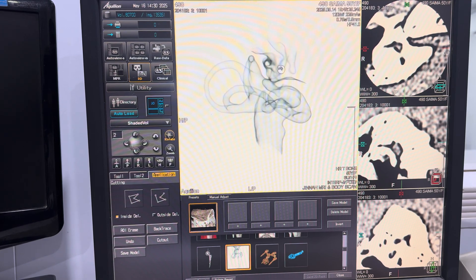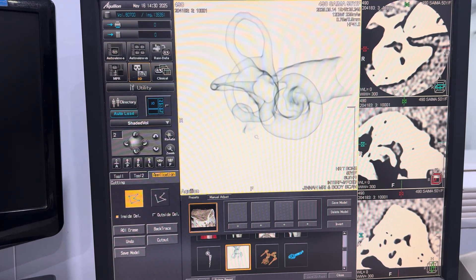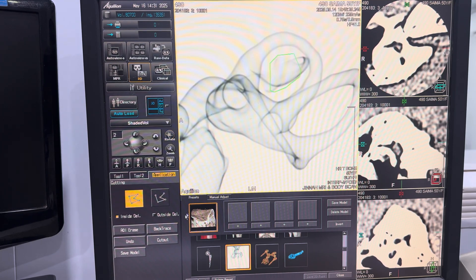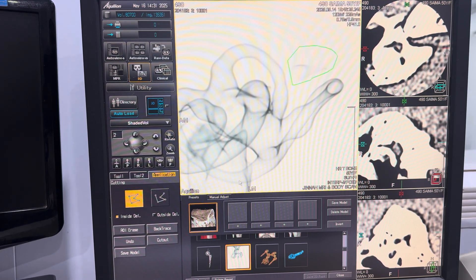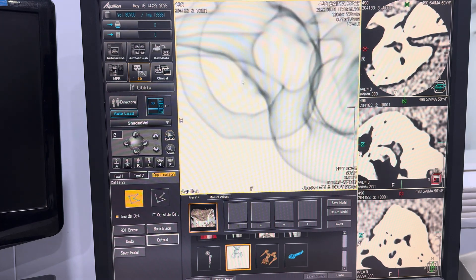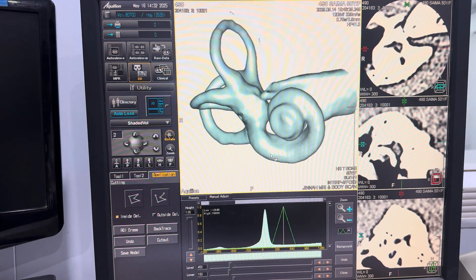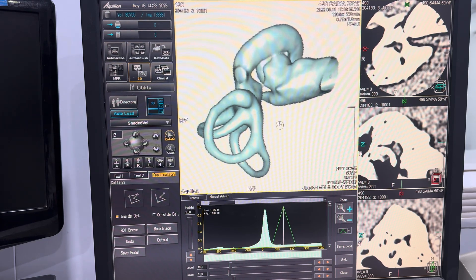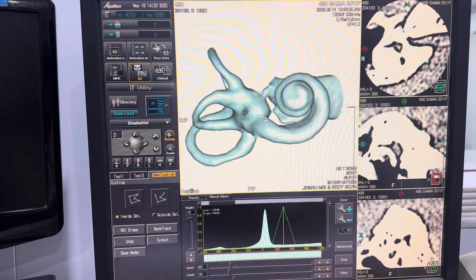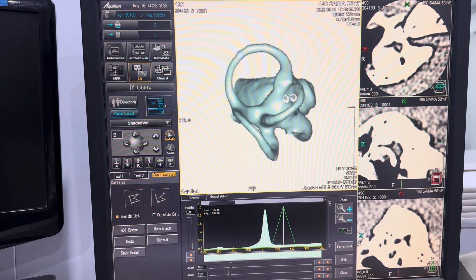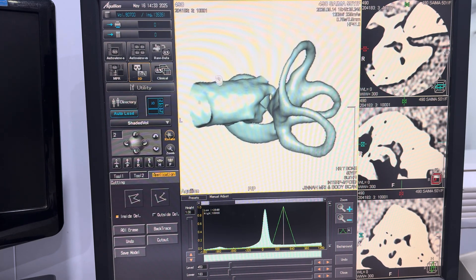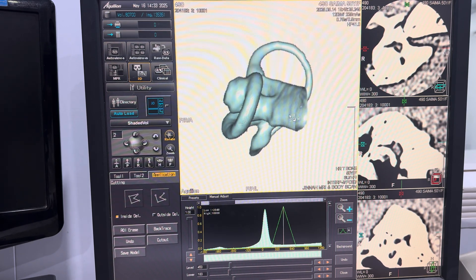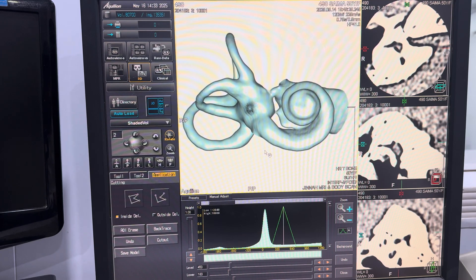Additionally, there are several advanced enhancements that can be applied to the 3D reconstruction to further improve visualization. For instance, the background color can be customized to enhance visual contrast and clarity. The 3D model itself can be made semi-transparent, and various color schemes can be applied to highlight specific anatomical structures. Furthermore, the model can be rotated and viewed from multiple angles, enabling a more comprehensive and detailed examination of the anatomy.